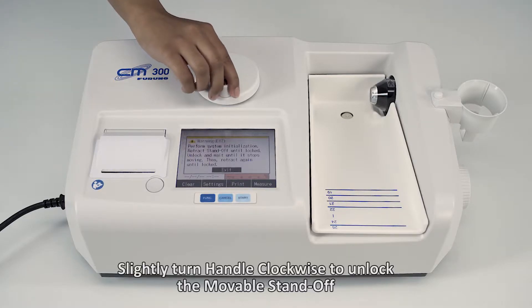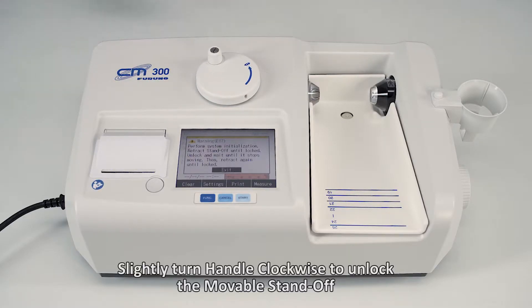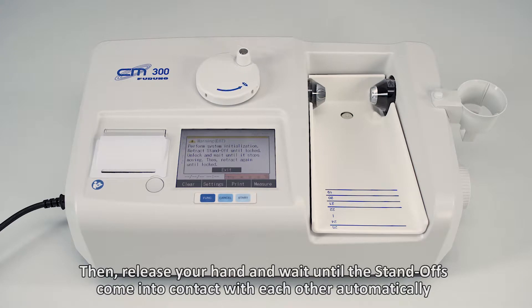Slightly turn the handle clockwise to unlock the movable standoff. Then release your hand and wait until the standoffs come into contact with each other automatically.